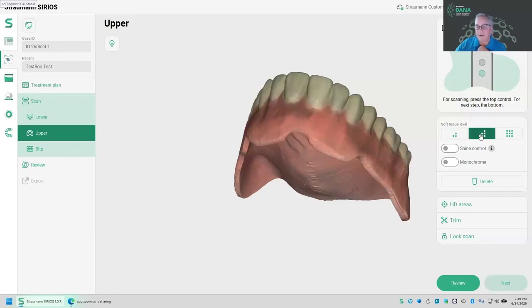Okay. Here, I don't have a number for you, but it's much further afield. So think long span bridges. But to your question about deeper vestibules: if you want to capture a deeper vestibule, you'll need to go to this middle section here. The one on the right actually turns off the soft tissue filter altogether. And I should have mentioned that for this scan, you would definitely want this, and it isn't tricking the software.